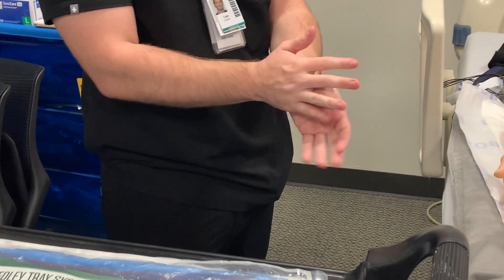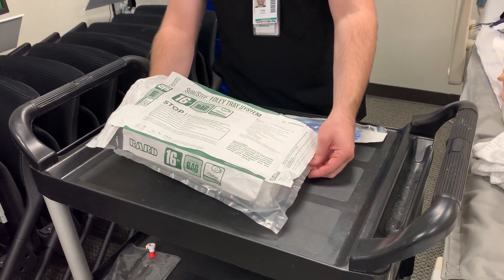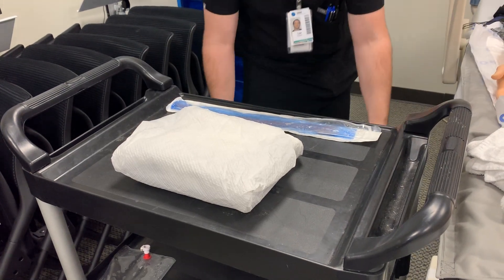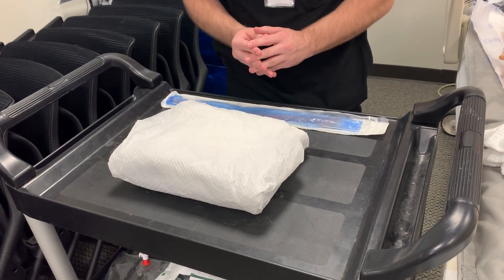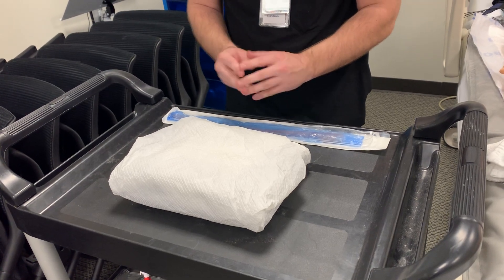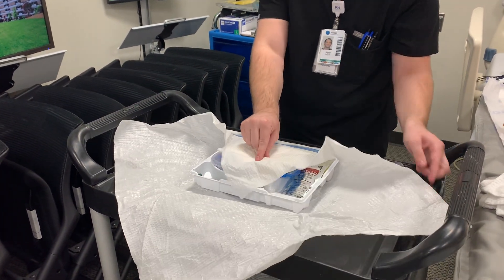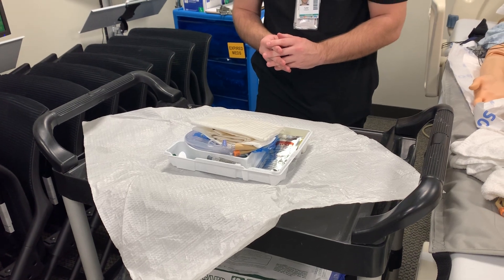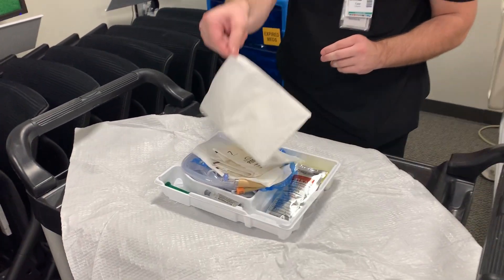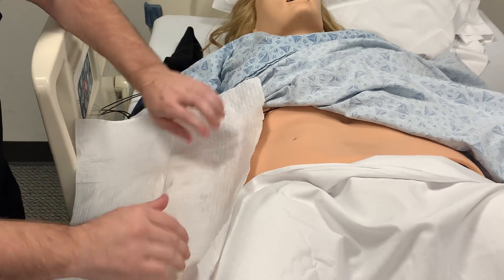To begin, we're going to perform hand hygiene again. Then we're going to get our catheter change system ready. You may have two items — the catheter change system and a separate catheter — or you may have a system that includes the catheter itself. The catheter change system is a sterile field. We will open the sterile field by moving away from ourselves, then left and right, then down toward us. At the top of the system, you will have a drape to prevent spillage — place it shiny side down wherever you choose.